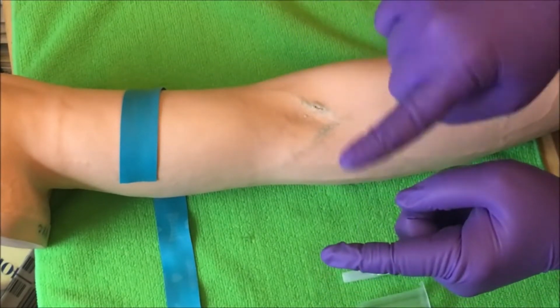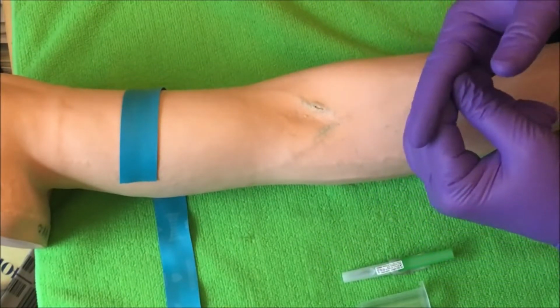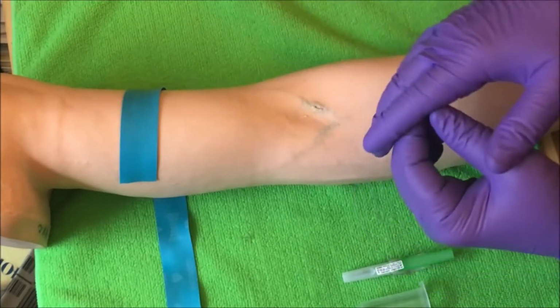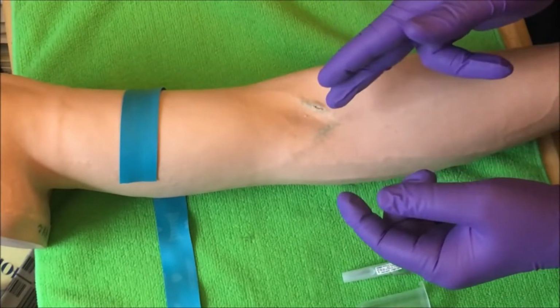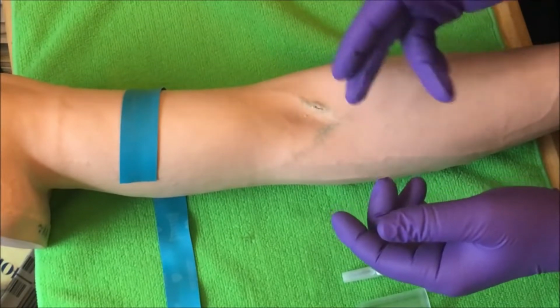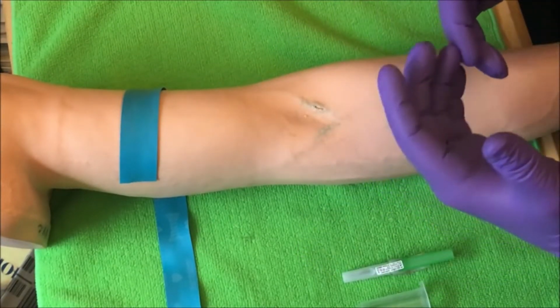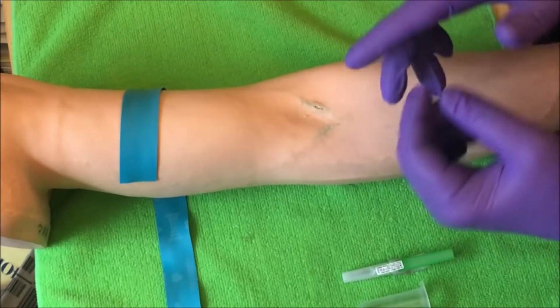But I do like to assess both arms and even the back of the hands in case I can't find a vein on the arm, specifically in the antecubital fossa area. I look for the median cubital, I look for the cephalic on the outer part, and of course the basilic on the inner part of the arm. Basilic is always last. I'd rather do the back of the hand, and I explain that in my other videos on the order of veins.